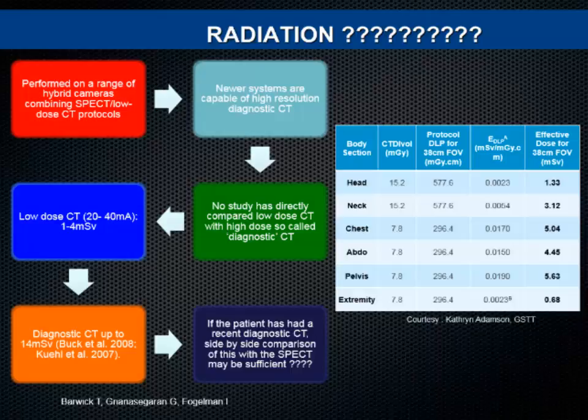For the benign, in this case, like for malignant patients, you're more in terms of localization, exactly where the pathology is. You'll see some sclerosis. Most of the time, you'll get off with a low dose CT. But if you want to do a high quality orthopedic study with multiplanar reconstruction and volume rendering and all sorts of fancy things, you need to have a high quality CT.